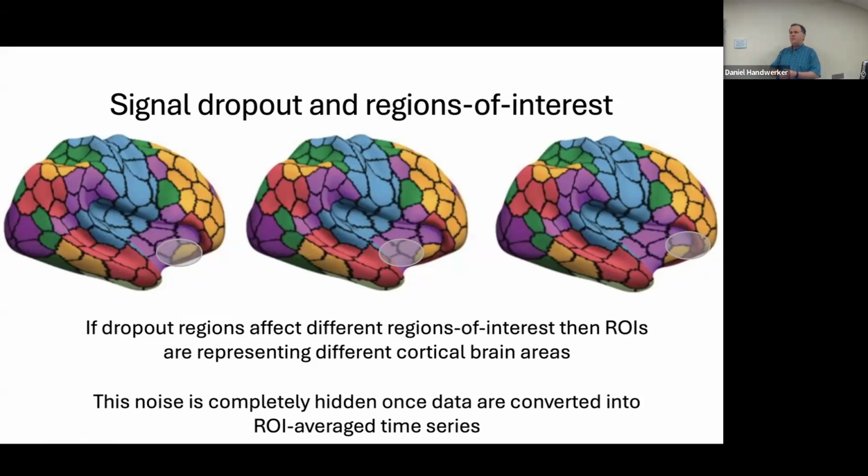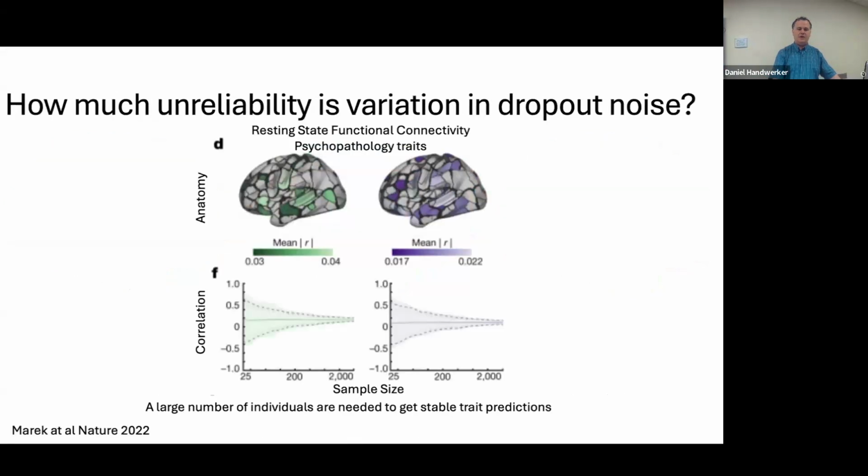So you're looking at a few million different neurons firing that are completely distinct from each other. And I think what's concerning about this is that once you've collapsed and averaged, this is hidden from the experimenter. There's really no way to say what am I looking at or not. So this is an analysis step you really have to be aware of and say, hey, this orange region of interest is just not reliable across my population. Maybe I just have to remove it completely. And a lot of people definitely do this, but I think it's something that merits more discussion.